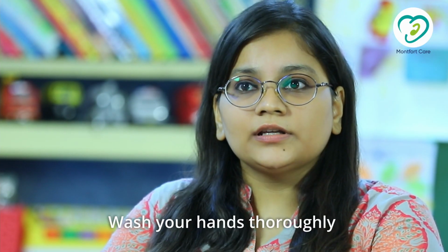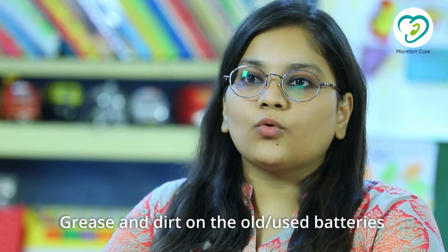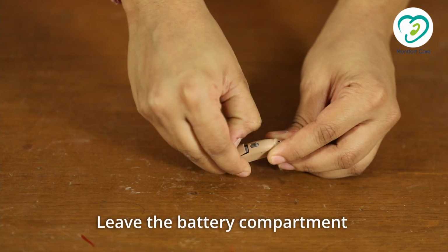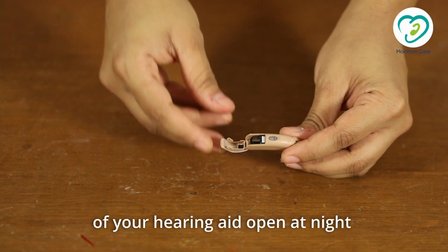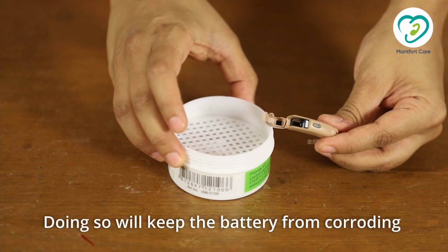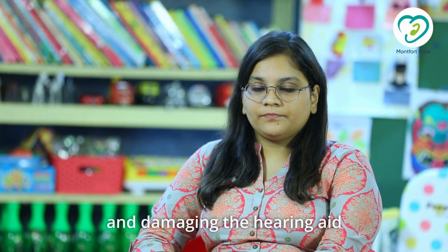Wash your hands thoroughly before changing batteries. Grease and dirt on the old or used batteries may damage the hearing aids. Leave the battery compartment of your hearing aid open at night so moisture can escape. Doing so will keep the battery from corroding and damaging the hearing aid.